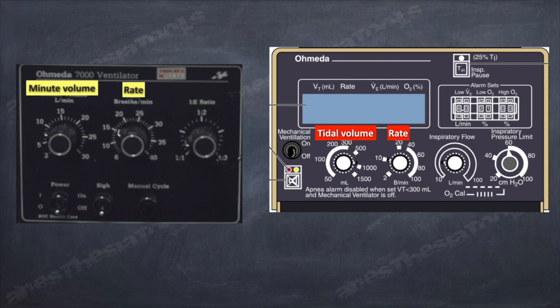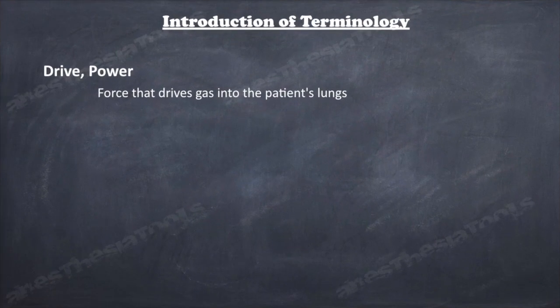The two common parameters missing here are FiO2 and PEEP. Remember, FiO2 is set at the level of flow control knobs in the anesthesia machine. Addition of FiO2 is an advanced feature appearing in newer versions. For the time being, let us stick to basic details. Let me revise a few terminology for you.